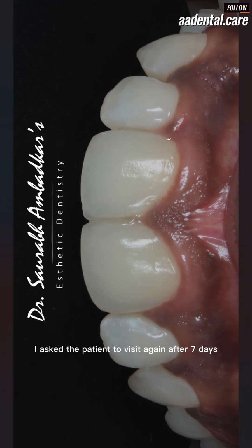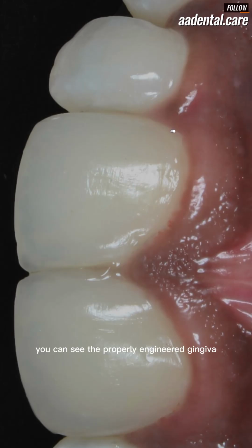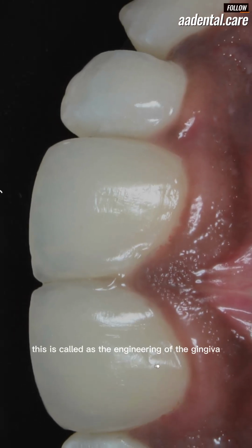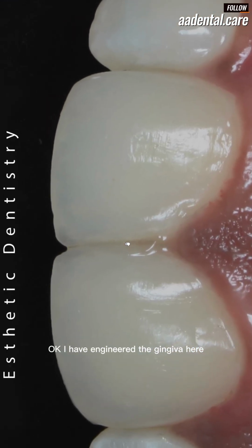I asked the patient to visit again after 7 days. So this is the photograph after 7 days of the treatment. You can see the properly engineered gingiva. The papilla is completely healed and fitted well into your composite. This is called the engineering of the gingiva. You shape your composite very well so that your gingiva will form around it. I have engineered the gingiva here.